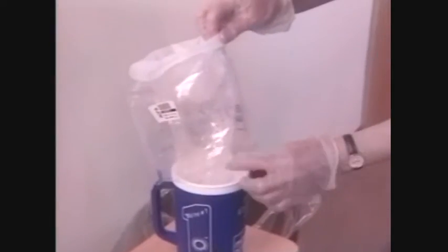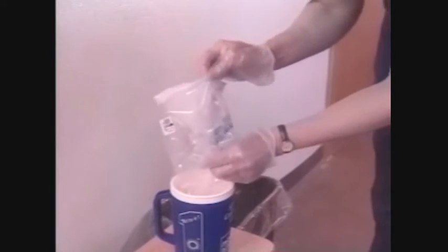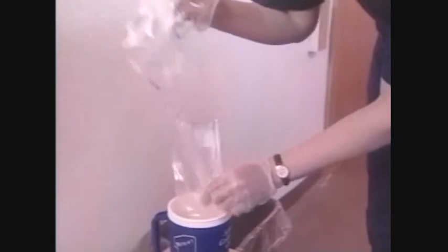After collection, the filter is removed from the collecting vessel. When using the mini-tube perforated plastic collection bag, its top is removed at the perforation to avoid contamination of the ejaculate. The ejaculate should be immediately transported to the lab after collection. When the boar has finished working, allow him to dismount. Return the boar to his own pen or crate.